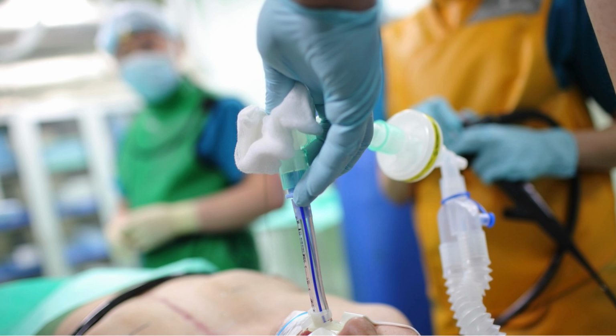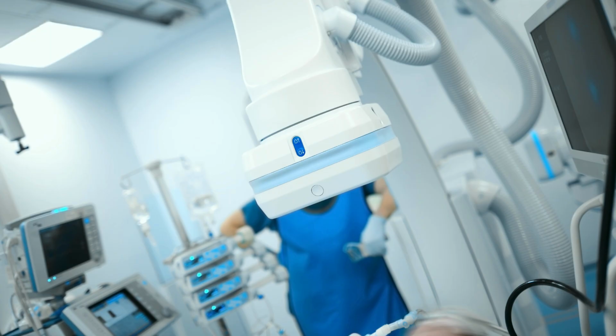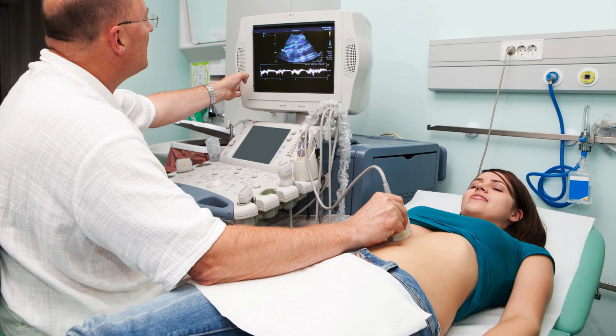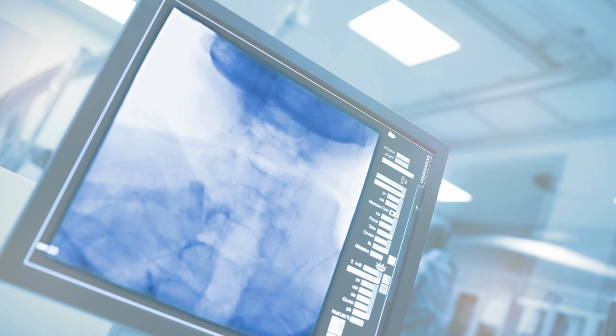Common cath lab procedures include cardiac coronary angiogram. This procedure evaluates the blood vessels supplying the heart using catheters and X-ray dye. Coronary stent placement, a procedure in which small metal scaffolds are placed within a blocked coronary artery to keep an artery open. Right heart catheterization, a procedure in which physicians examine blood flow and pressure filling in the right side of your heart.